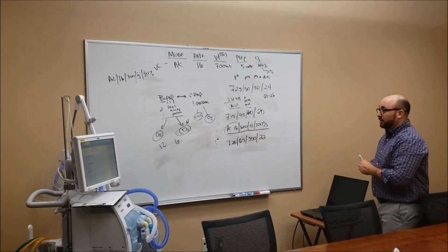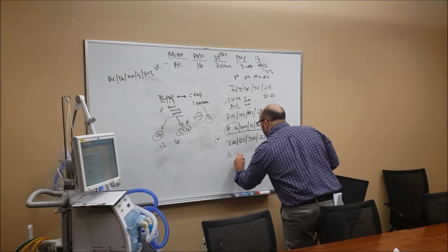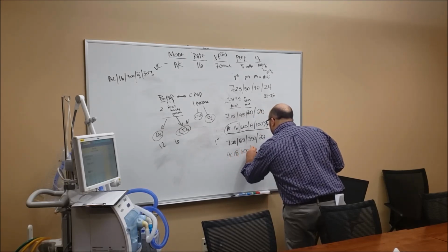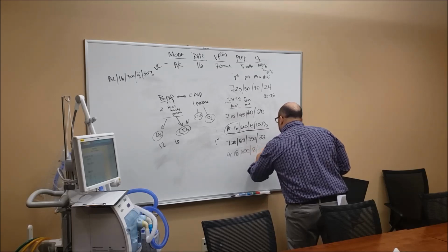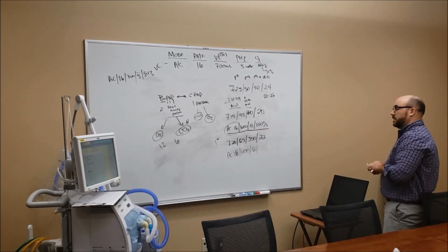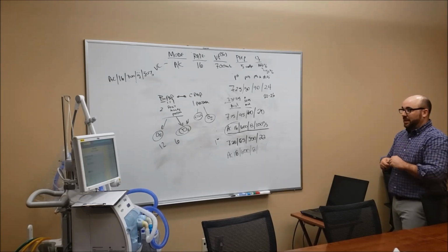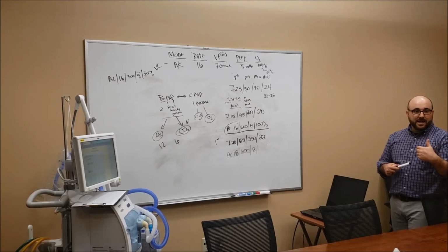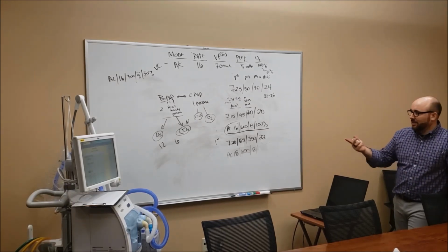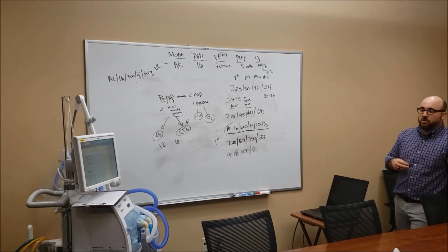So that would be a good thing to know, if your patient came in on assist control and you were reporting to the nurse upstairs, or whoever you're going to report to, you'd say, we'll look at the oxygen, but initially we put them on a rate of 16, they came back still acidotic, so we upped it to 18. Because they may ask you, wow, 18, that's kind of on the high end. Well, their gas came back acidotic after they're on the vent. It's always good information to know and report.